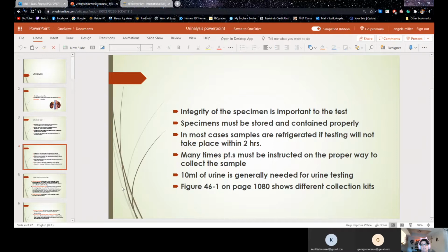So it is vital that when we get a urine sample, I always tell everybody, within 5 minutes, if possible, of the patient giving you the sample, go ahead and run the test. I always say, get a specimen in a urine tube if it looks like there's an infection, because the doctor's going to want you to send that off, okay?